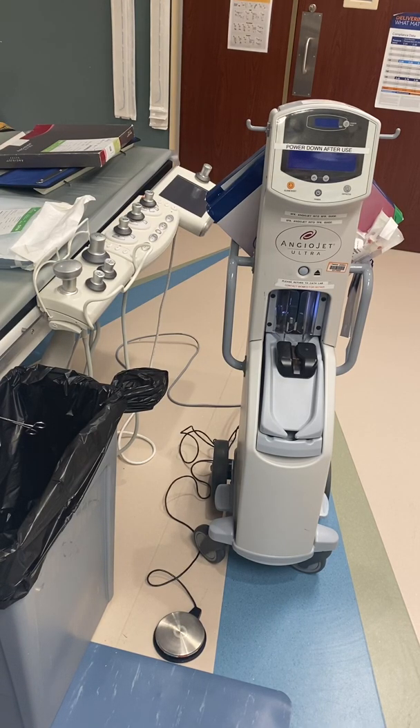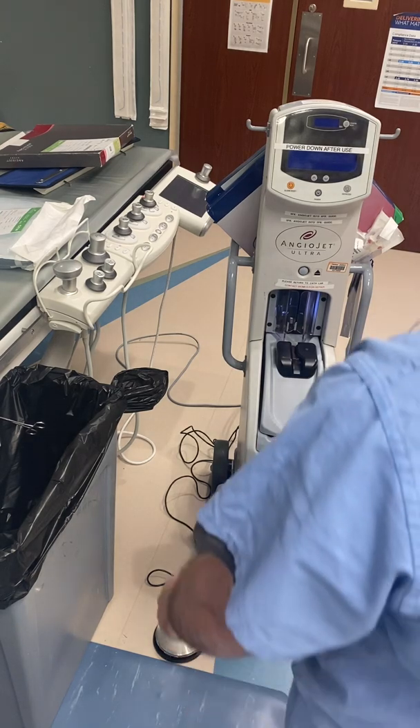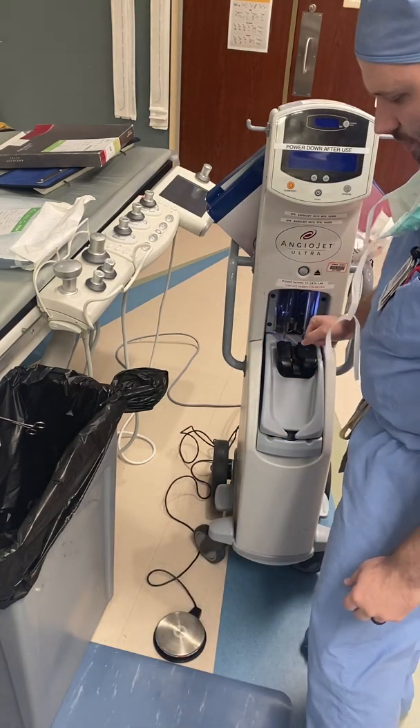Hi, how's it going? I wanted to go over some of the basics on the AngioJet today. I'm going to show turning it on, getting a catheter out, priming it, and having it ready to use. I also have this tubing set up with some fake clot and fake blood, and we're going to show getting access with a six French and going in with the AngioJet to hopefully get rid of the clot and see how it works.